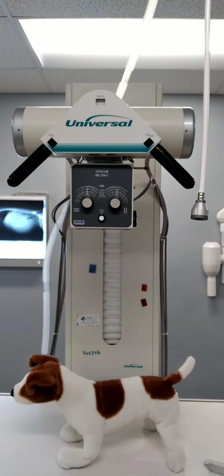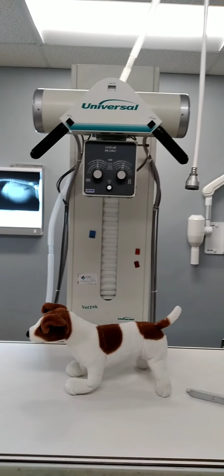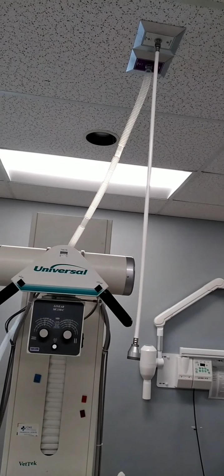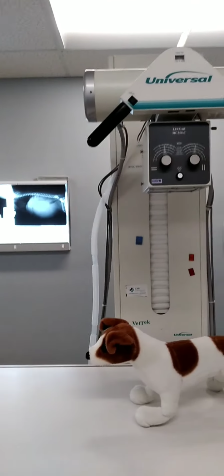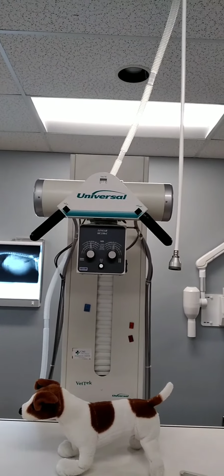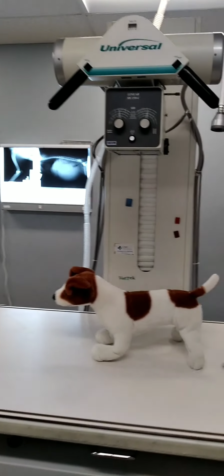This room by design has also been hooked up for oxygen in case we have to bring in an anesthetized patient. So you can see that white short line that's going right up to the ceiling. That is our oxygen line. And then the corrugated plastic tubing that's coming down behind it, that would be waste gas. So we could absolutely have an anesthetized patient in here and bring an anesthetic unit in and continue an anesthetic if we needed to. And that is your X-ray room.